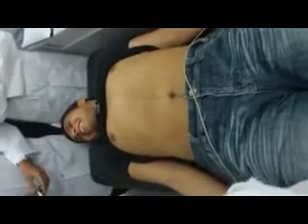Class connected? Just not very tight, but some tight. Okay, now listen. Check which one is C1. Press the rubber with the thumb like this. No, you will hold like this. Hold and attach at the level of V1, because this is C1.